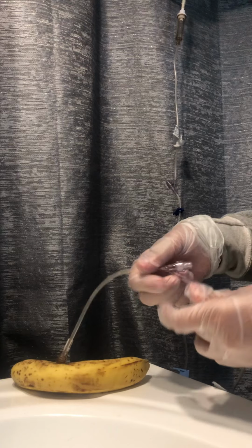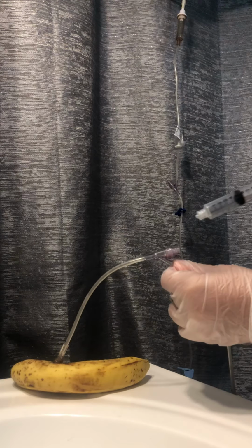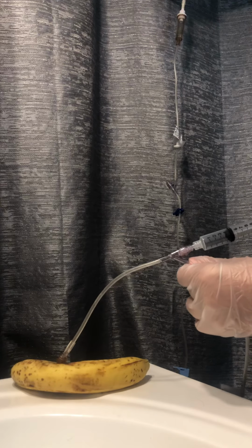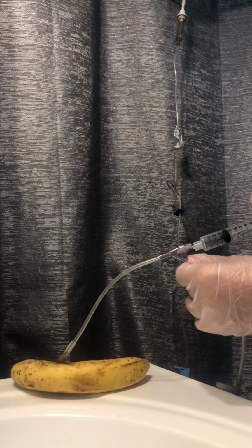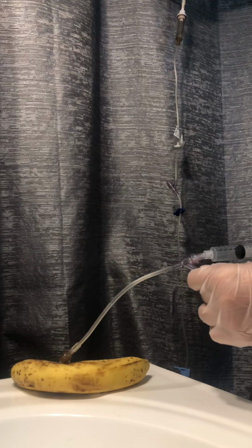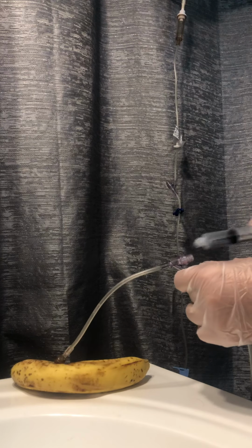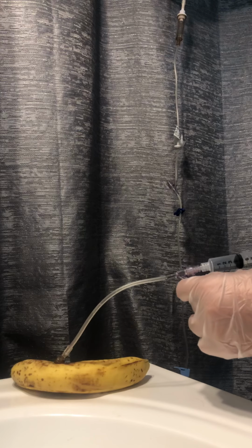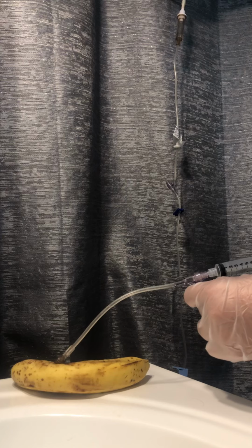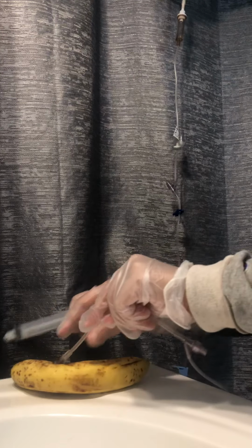Pinch. We're going to put 2 mLs in slowly. 2 mLs are in. Aspirate, check for blood. We see blood. So now slowly we're going to inject the 8 milliliters left. Okay, now we are ready for our Lasix.